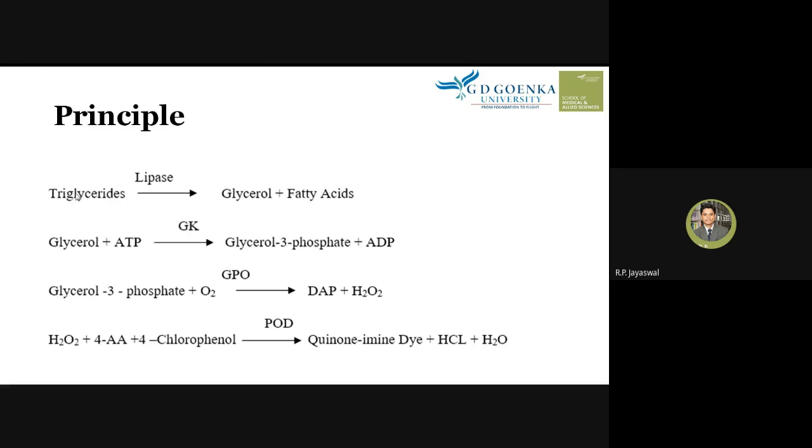If the sample contains triglycerides, then the lipase enzyme present in the reagent can break the triglycerides into glycerol and fatty acids. Okay, so this is the first reaction which can occur with the help of the reagents. The lipase present in the reagents will hydrolyze triglycerides in the sample and produce glycerol and free fatty acid. Now the product of the first reaction is glycerol. Can you see the glycerol? Yes. So this glycerol will be consumed in the second reaction.